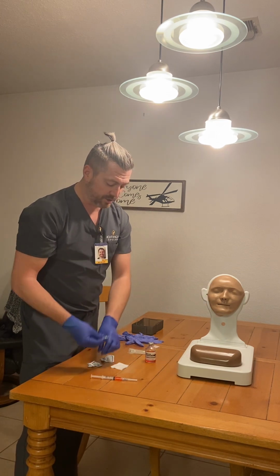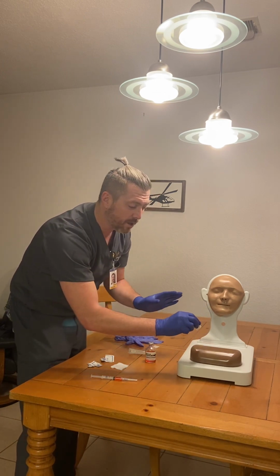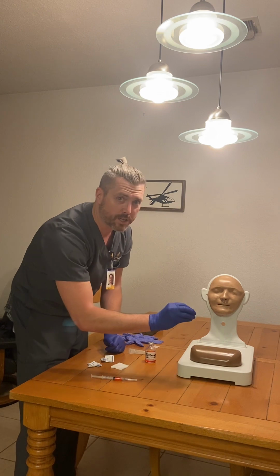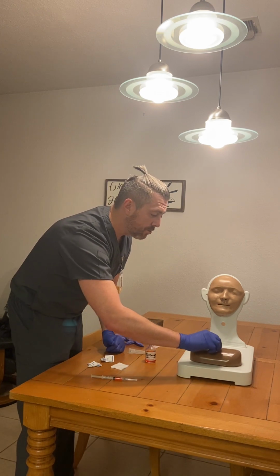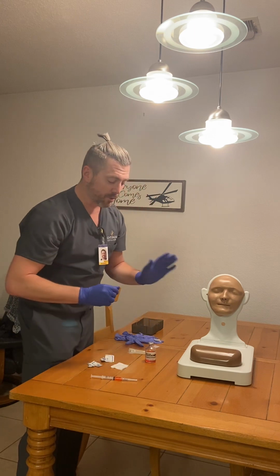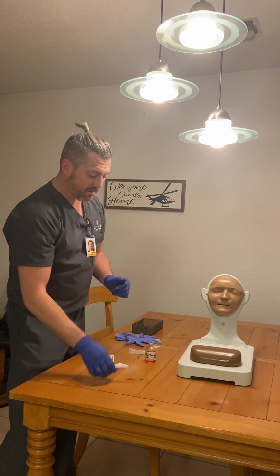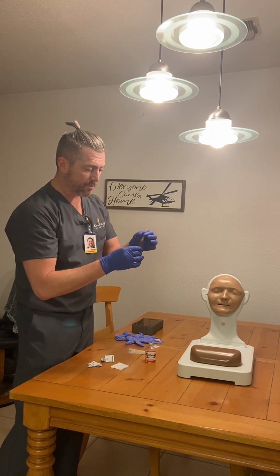So we'll use our second alcohol prep, and I'm going to clean from inside out in a circular motion about 2 inches, and then we're not going to touch it again. Cleaning inside out, dispose of that. We're going to let that dry. After that's dried, we're going to remove the cap.